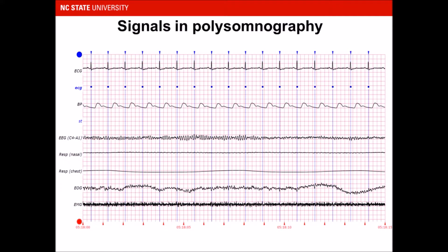The following is just a sample of how a typical polysomnograph looks. We have ECG, blood pressure, EEG, nasal respiratory, chest respiratory, EOG, and finally EMG.